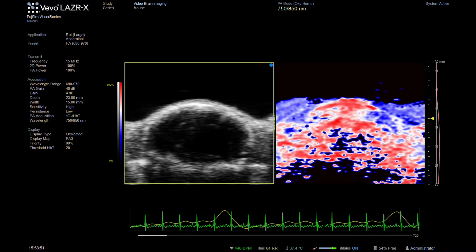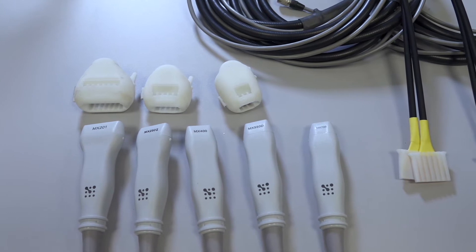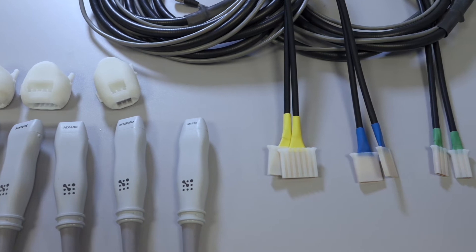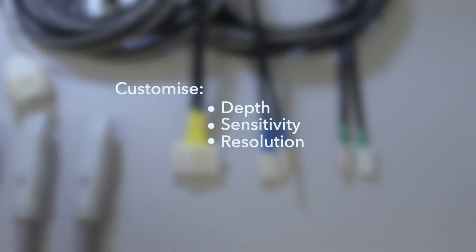A key benefit of this system is the flexibility of photoacoustic imaging. We supply a range of transducers that can be fitted with a selection of optical fibers. This means you can customize depth, sensitivity, and resolution depending on your application.